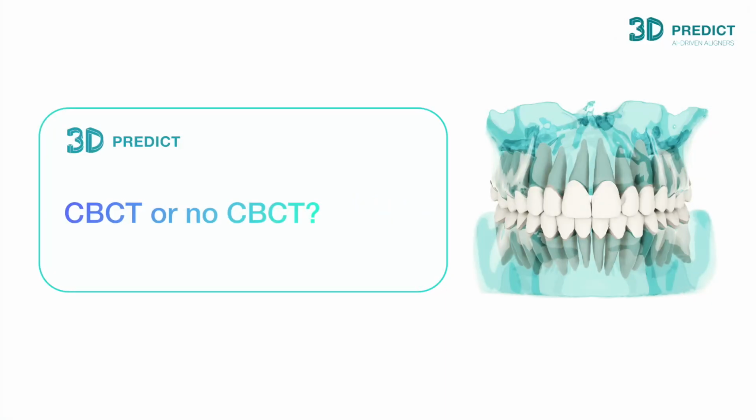A popular question from our doctors is if they should submit a CBCT for a case. Although you can always schedule a call with us to discuss a specific scenario, let's review some general guidelines that will help you decide between CBCT or no CBCT.